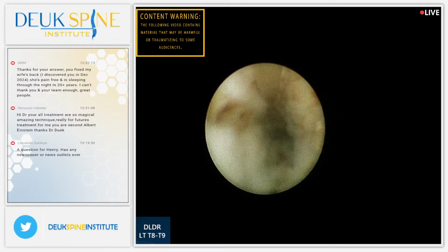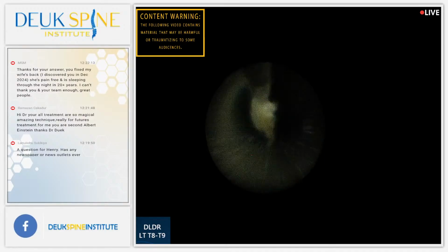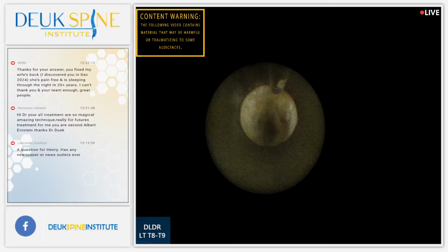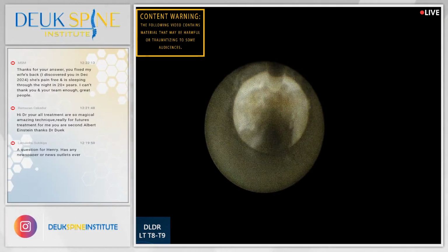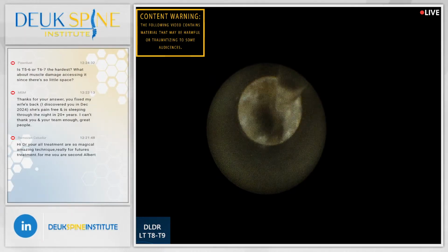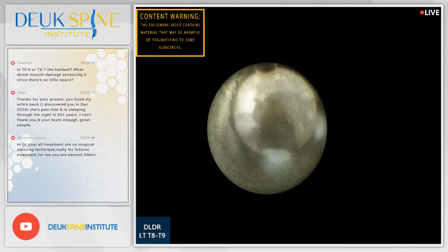I got about 1 minute left and we're done. So if you have any other questions, ask me now. But surgery went very well for him, and I'm just going to be doing finishing touches right here. No current questions, but we do have a... Let him go. Let him go. I'll just see him tomorrow.